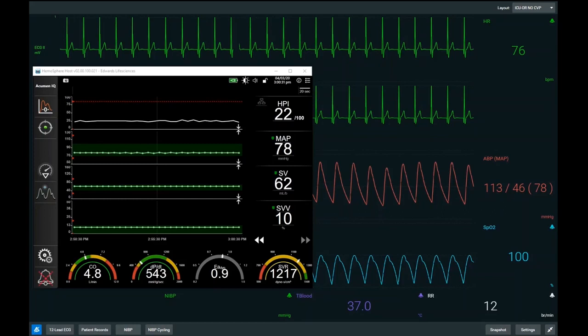To orientate ourselves, we have our basic patient monitor in the background showing our ECG, our invasive blood pressure monitoring from a radial arterial line, and our saturations. In the foreground we have our advanced hemodynamic monitor — HemoSphere — and the four parameters we're currently trending are our HPI or Hypotension Prediction Index, our mean arterial pressure, our stroke volume or SV, and our stroke volume variation SVV, a measure of being preload responsive.